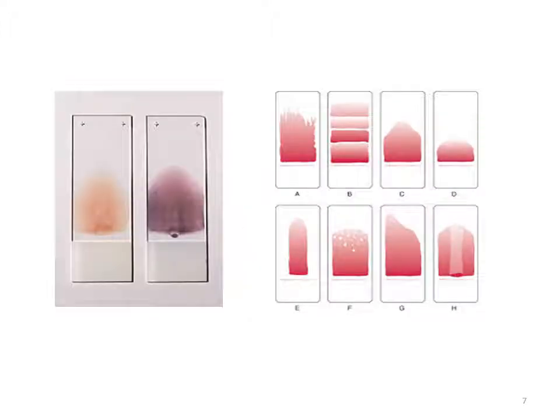The unstained and stained slides to the left represent an ideal peripheral blood smear. The shape looks like a bullet, with 2/3 the length of the slide and a thicker end at the frosted side. There should be uniform staining without debris or artifact. The cluster of slides to the right represent poor quality slides.